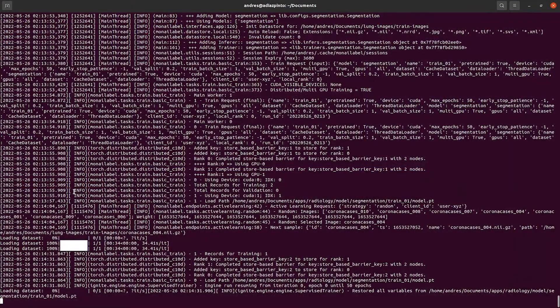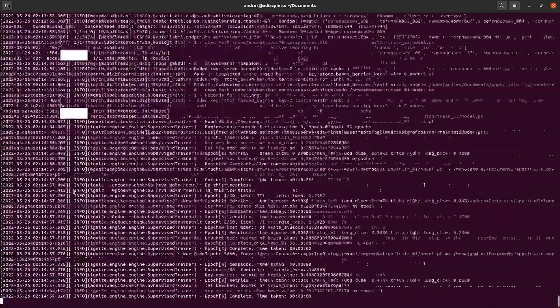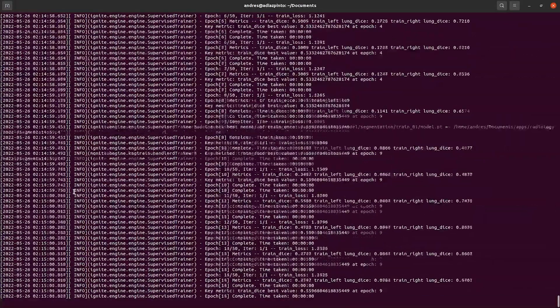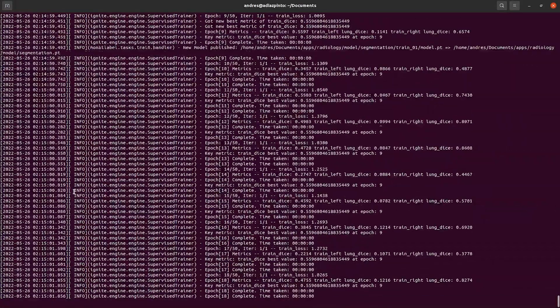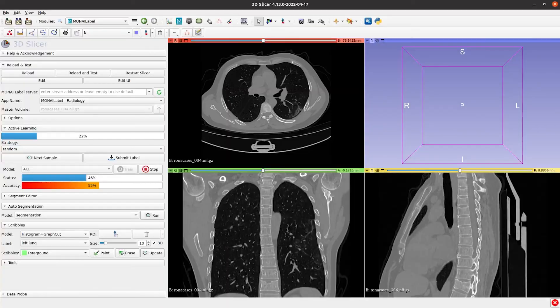Every time that you hit the button Train, the model is trained for 50 epochs. But you can change this value in the Options tab, and the variable name is MaxEpochs.